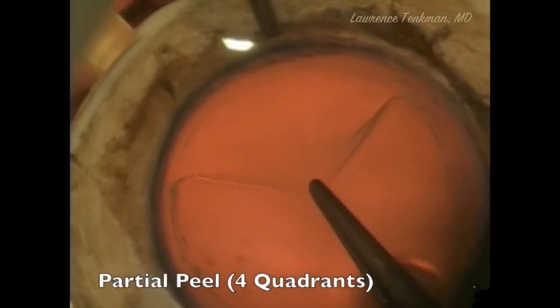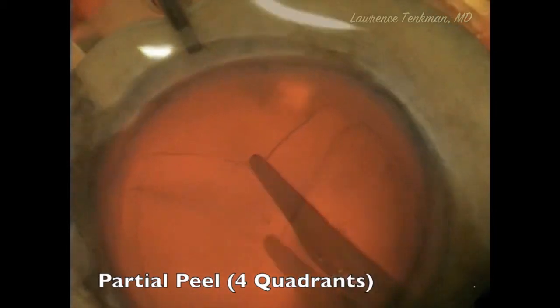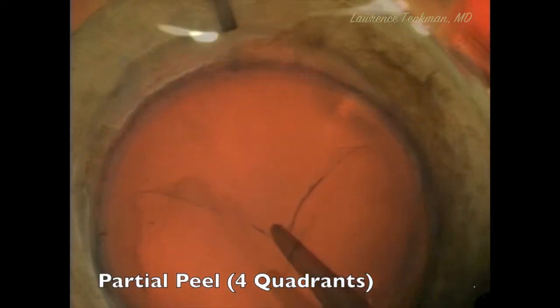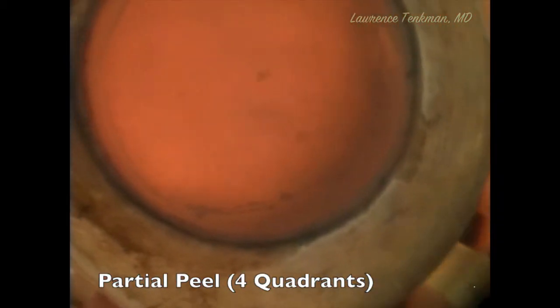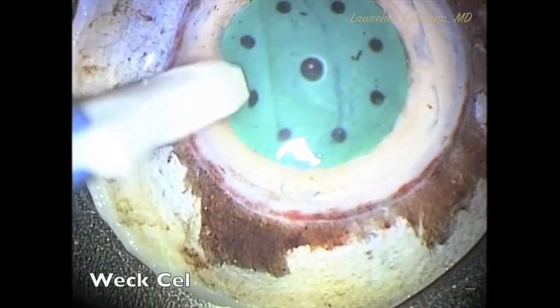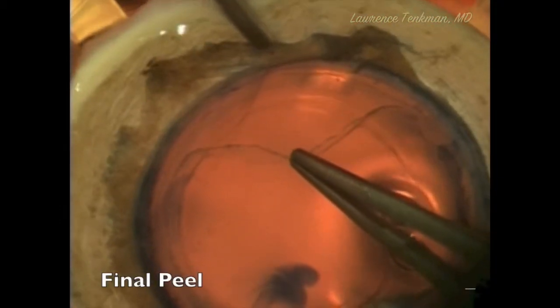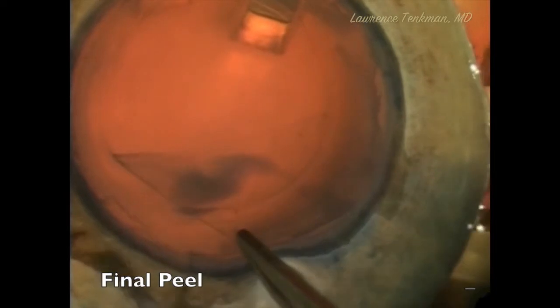Here I am partially peeling the four quadrants. The first peel is taken halfway to the middle; exactly 180 degrees away, I take the second peel halfway to the middle. Then I rotate 90 degrees to the side — this peel has a narrow corridor of unpeeled tissue, so I can easily take it all the way to the center with minimal tension. The final quadrant comes from 180 degrees away, and I take this only halfway to the middle. The donor is taken to the cutting block, fluid is soaked away, the donor lays flat, it's trephinated, stained, resubmerged, the outer skirt of Descemet's is removed, and the final peel separates right when the forceps get there. We have a donor.